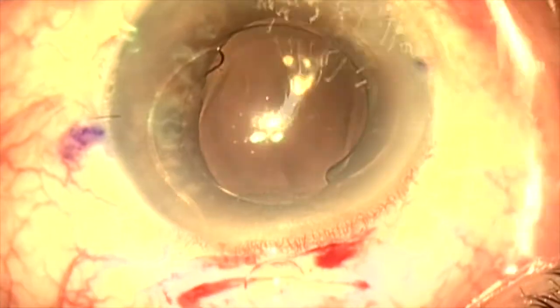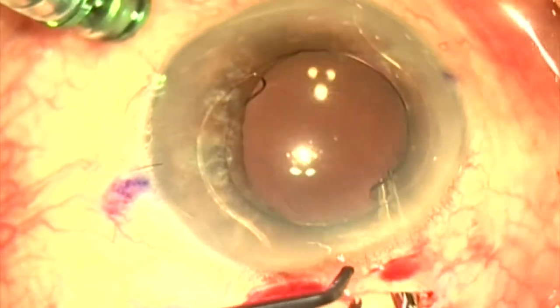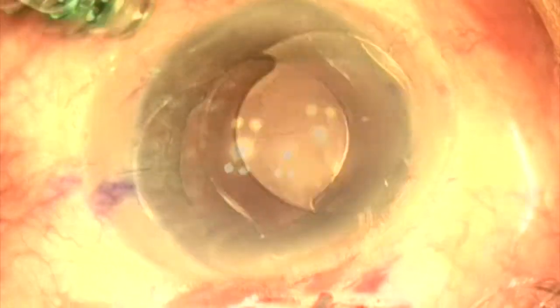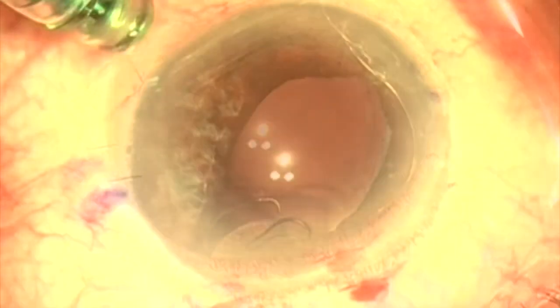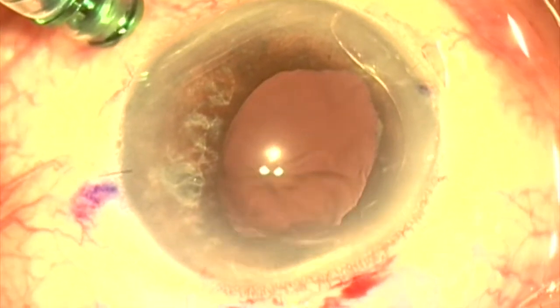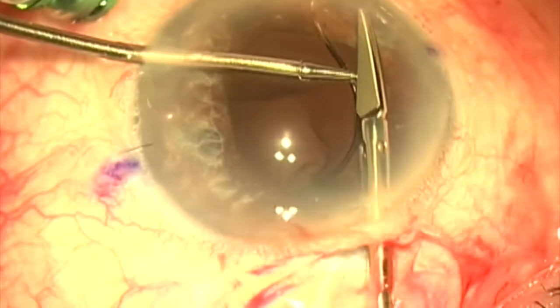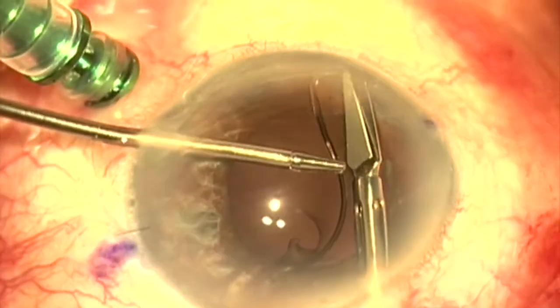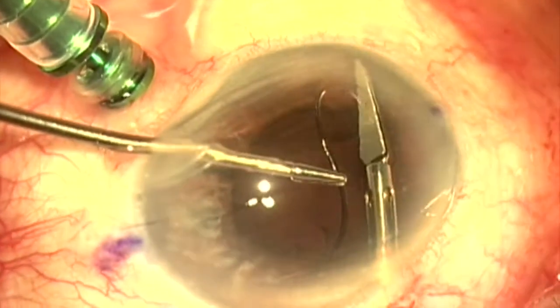The anterior chamber is entered with the keratome, and an MST scissor is used to cut the haptic so that we can remove the lens in one piece. We're now going to try to remove the haptic remnant by cutting it very close to the base of where it inserts into the tunnel of fibrosis.